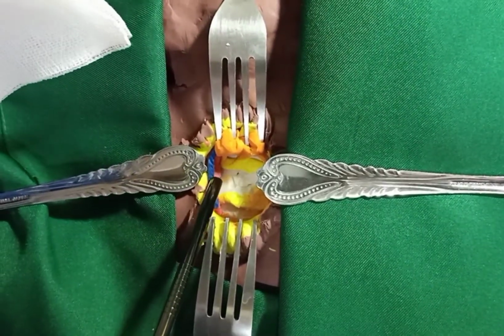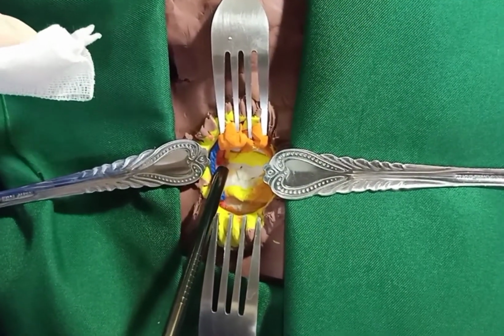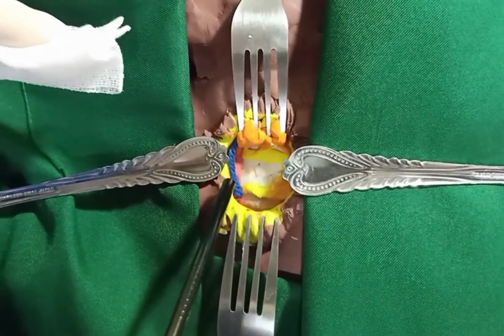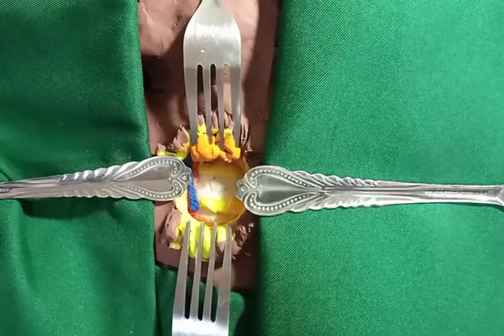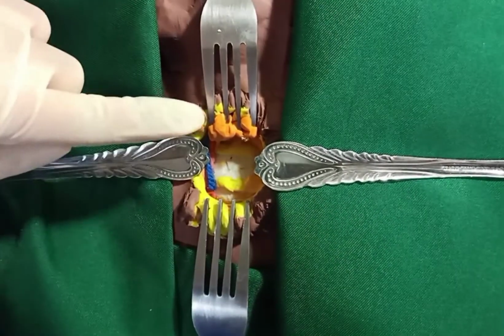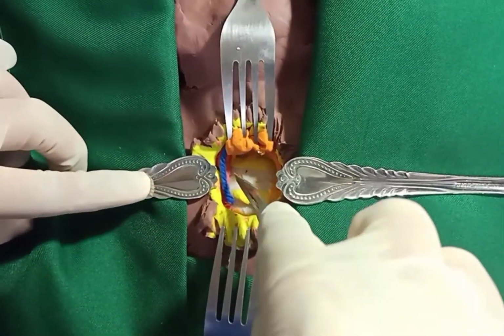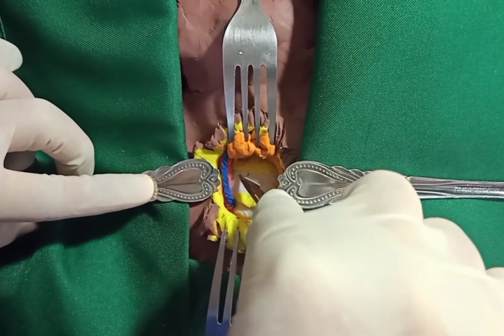Now ensure that the surgical field is completely dry before proceeding, as it is difficult to achieve hemostasis once the tracheostomy tube has been inserted. Once the tracheal area has been visualized, communicate with the anesthesiologist to ensure safe FiO2 levels. You may now make an incision on the trachea.